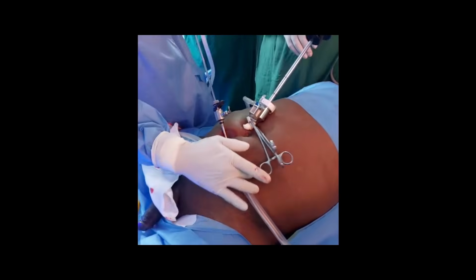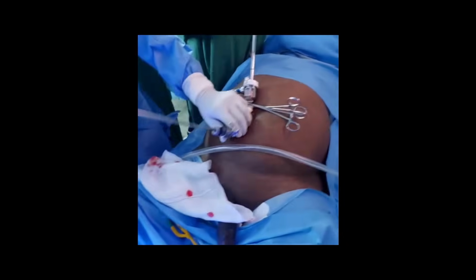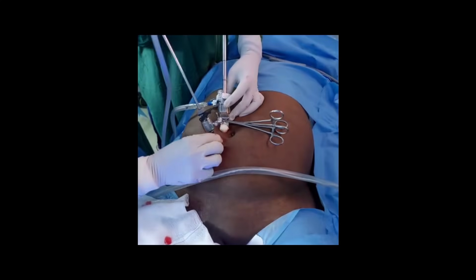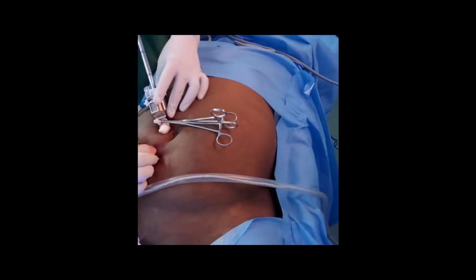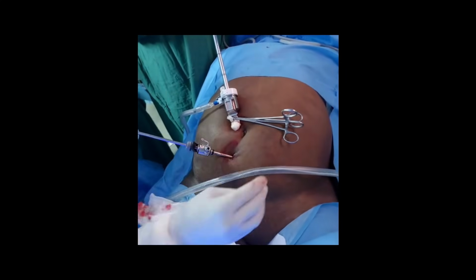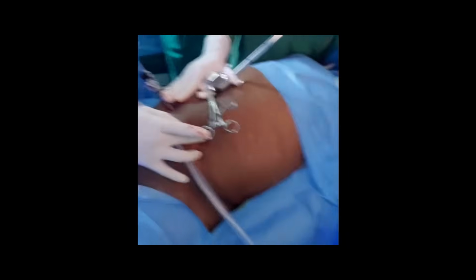To make a transverse incision, you can identify the anterior rectus, split the rectus muscle, and you can see the posterior rectus. On the posterior rectus, you can take 2 stitches initially itself, which will be helpful in closing after the procedure. Then go with a finger-guided dissection in the anterior aspect of the rectus fascia up to the arcuate ligament; below that it will be the peritoneum alone in front of the bladder.